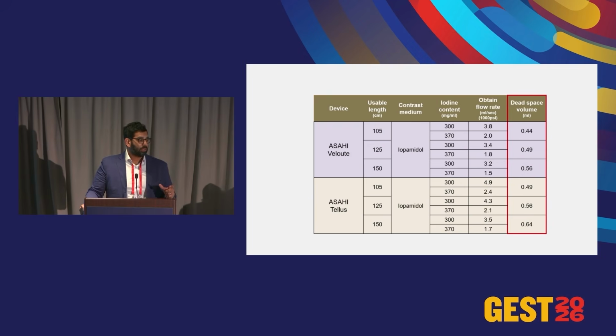So a quick note about the power or optimizing flow rates. You would think, 1.7, 1.9, well, I'm not going to be able to get great contrast runs, but as you can see, even with the 150 catheter and an IsoView 300, you can get 3.2 cc's per second through the 1.7.